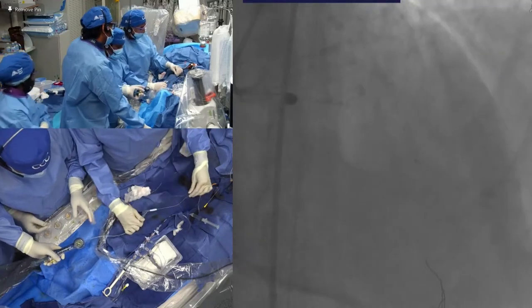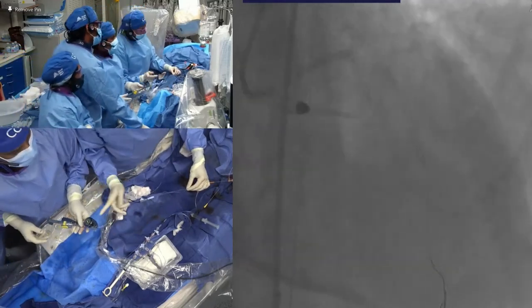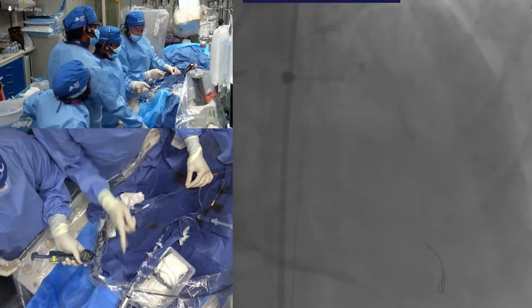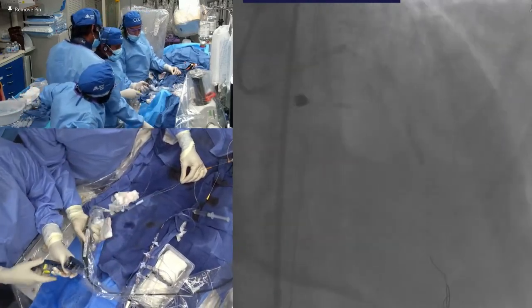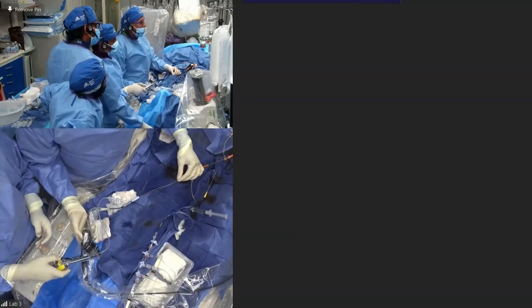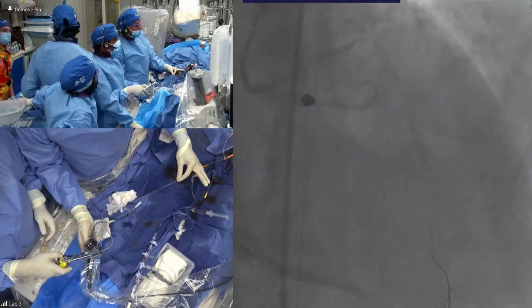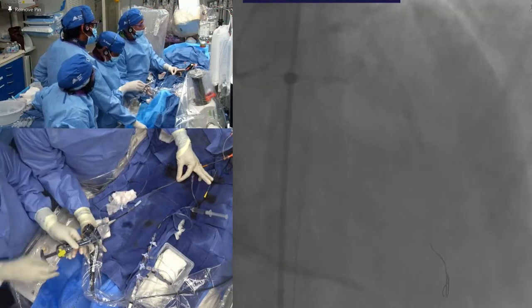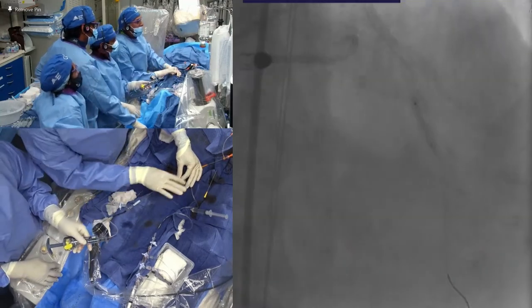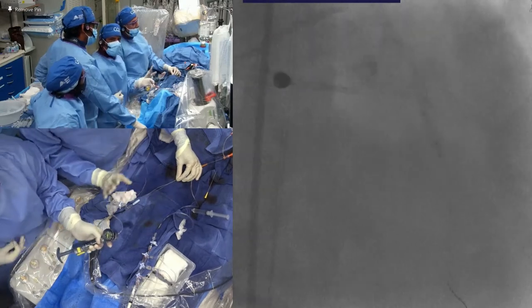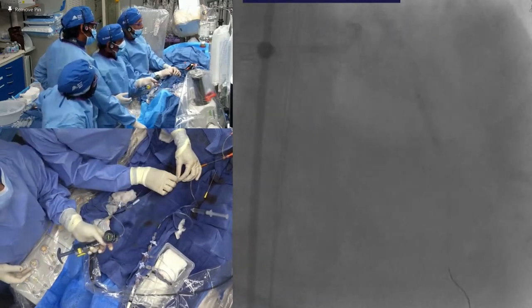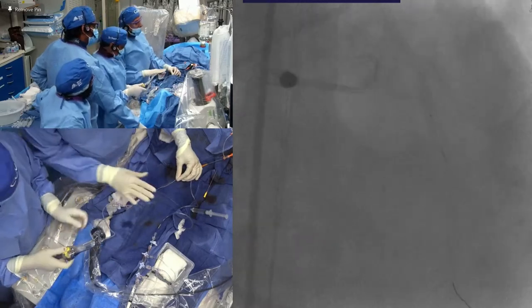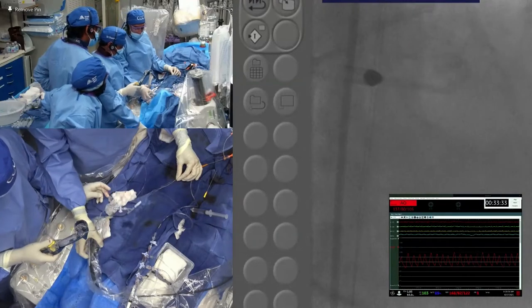The coronary lengths are 12 millimeters. Go up to four atmospheres - okay, four atmospheres. And then there's the button here. They should show the animation of IVL on screen. There are eight cycles of 10 pulses per catheter. We're running it now - I'm kind of doing it as we talk because I don't want to leave it in this lesion. That was one. The lengths are 12, now go up to six atmospheres. The pulses are delivered with the balloon at four atmospheres. After the pulses are delivered, we go up to six to see if the dog-boning is released. It's still there, so now go down to zero, then go negative. You've got to reprep each time, because bubbles can get generated which will decrease the efficiency of subsequent trains.